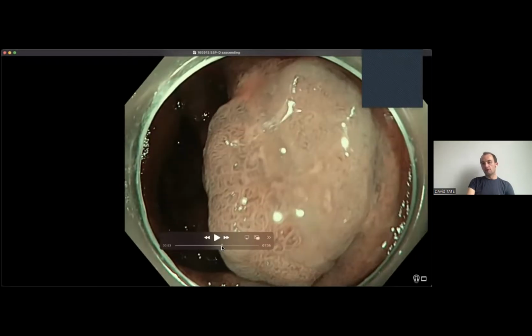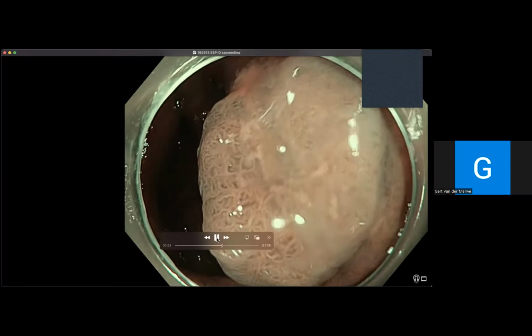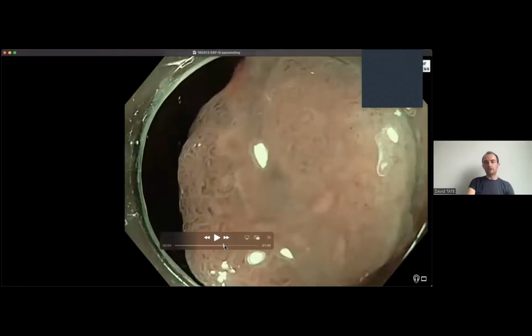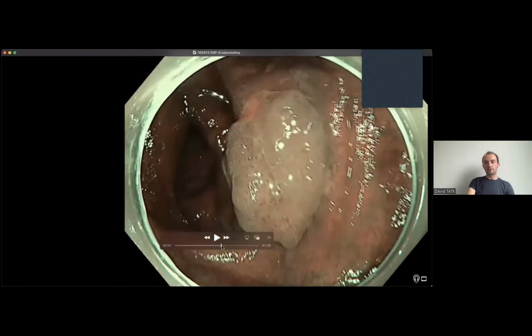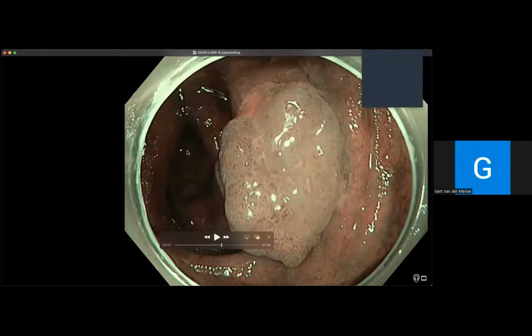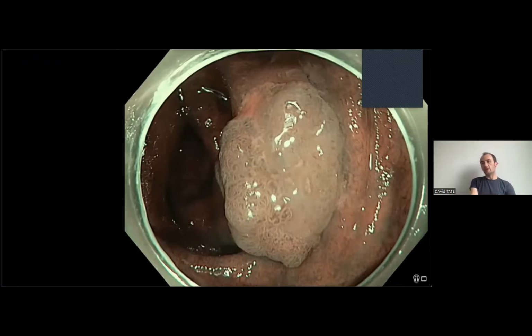So which side of it, the right or the left here, are you saying is demarcated? The right side. So the right side is a demarcated area and the left side is the normal polyp. Is that fair enough to say? Yes, I agree. So then we are looking quite closely here at that demarcated area. So what do you think? Do you think it's cancer?